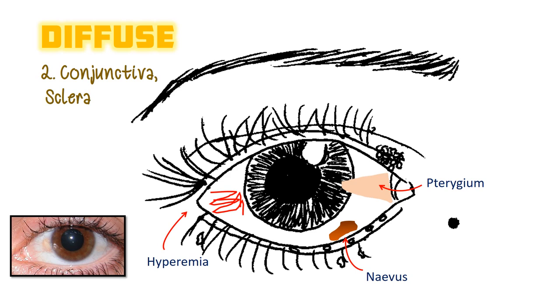Then look at the bulbar conjunctiva and sclera, still using a diffuse beam. Things to look out for would be hyperemia, nevus, pterygium, pinguiculae. Complete lid eversion is usually only done on indication — for example, if the patient comes in with a red eye or you're suspecting papilla or follicles, or a patient with giant papillary conjunctivitis.